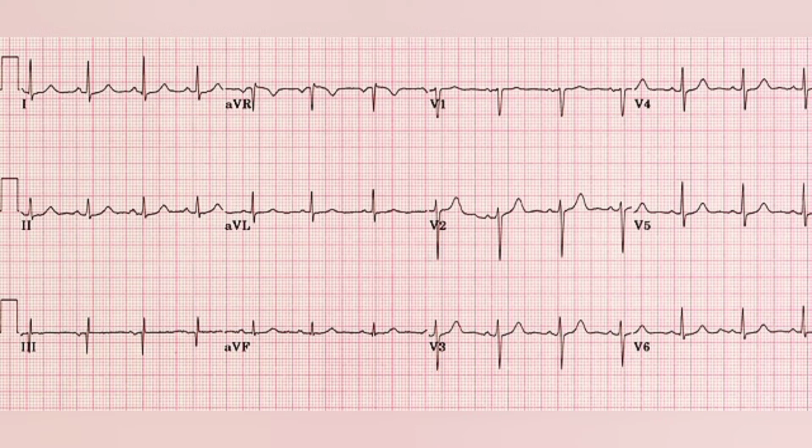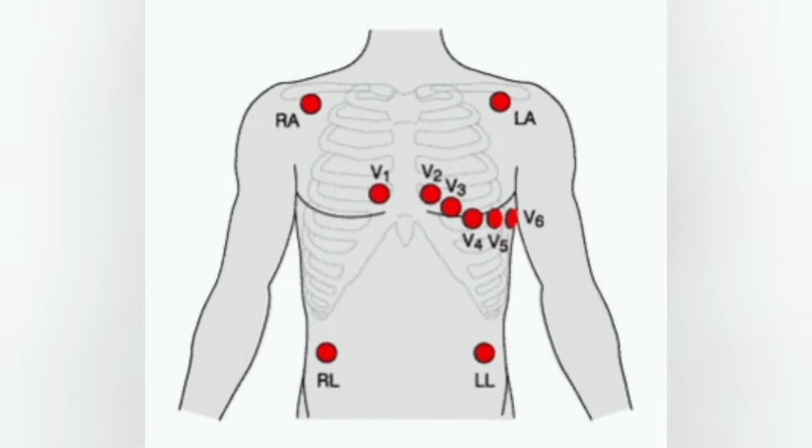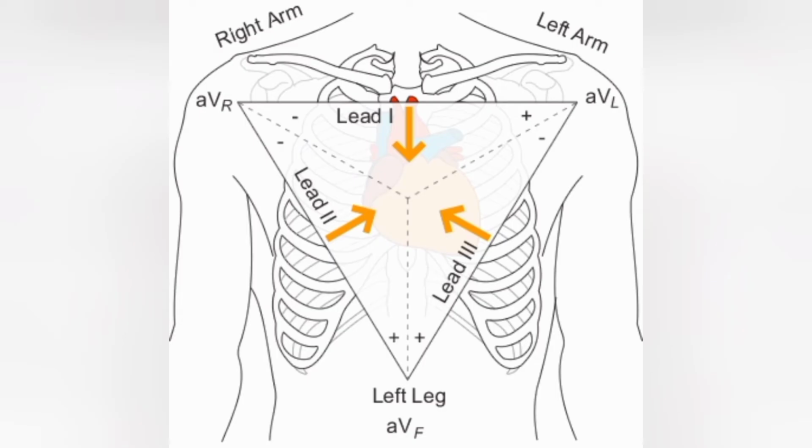The ECG machine processes the signals picked up by leads attached on the skin and produces a graphic representation of the electrical activity of the heart. A standard ECG comprises 10 leads to obtain the 12 electrical views of the heart, 4 on the limbs and 6 on the chest area, as shown in the picture. The three bipolar limb leads are lead 1, lead 2, lead 3. This reflects the difference between two of the three limb electrodes.